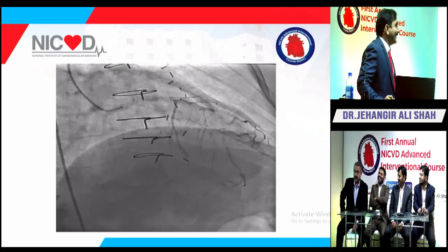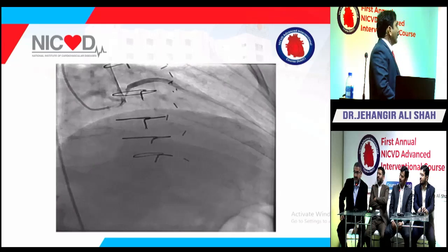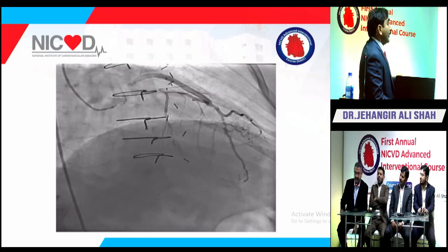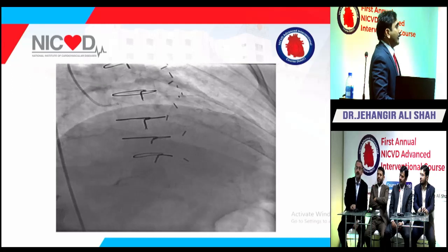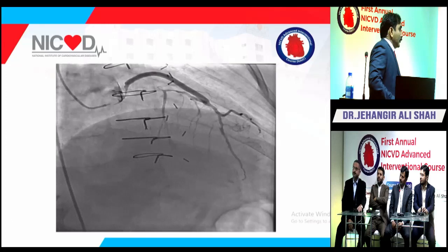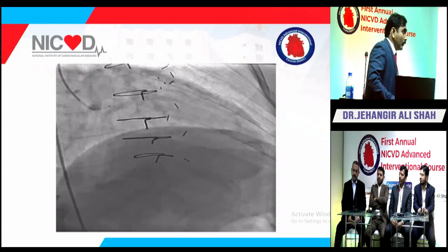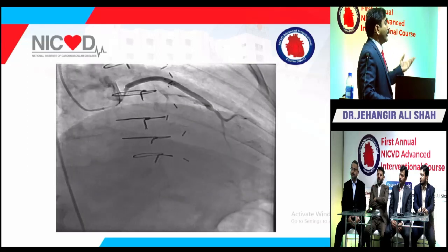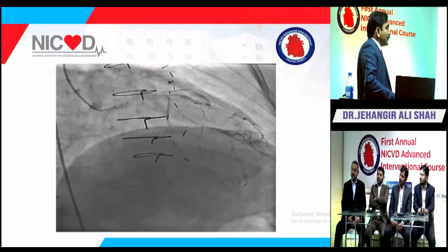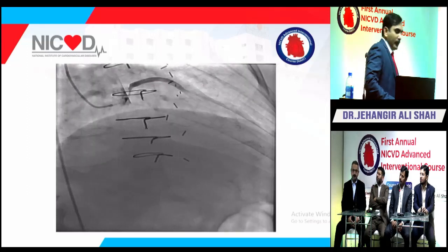Dr. Jahangir, I'm coming to you. Was it difficult to engage that SVG to LAD, or did you deliberately not engage it because of pressure damping? Actually, I was afraid, because every time there is an aorto-ostial lesion, there is difficulty engaging, and the chances of ischemia and dissection are more. So you have to be very careful, because diagnostic catheters are not too soft, and the chances of dissection are more in this patient.